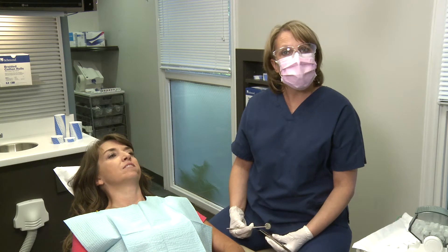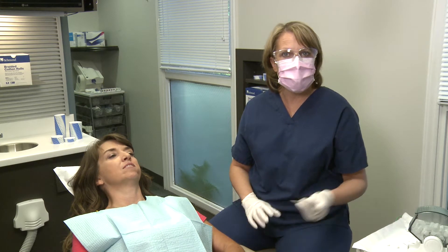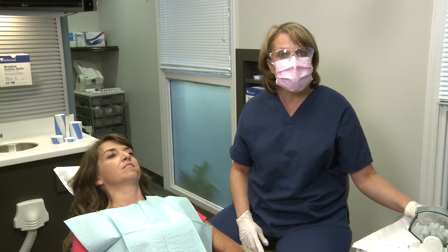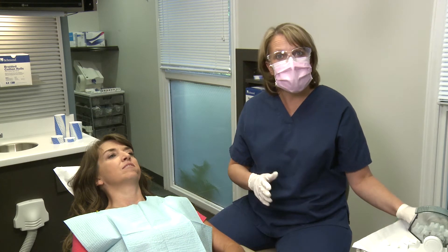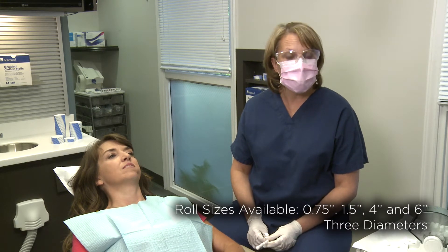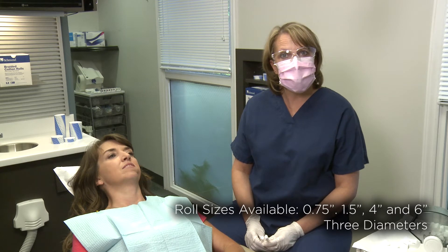Richmond's Braided Rolls retract while also remaining comfortable for the patient. Dentists can use considerably less rolls per procedure because of the braided rolls' durability and integrity. The most common size is the one and a half inch roll.